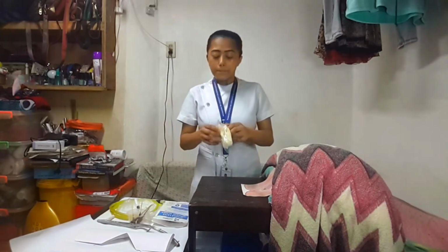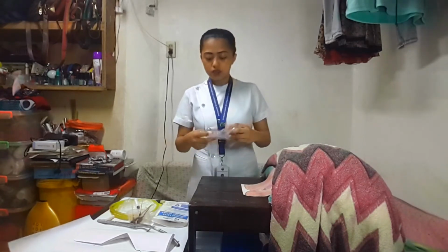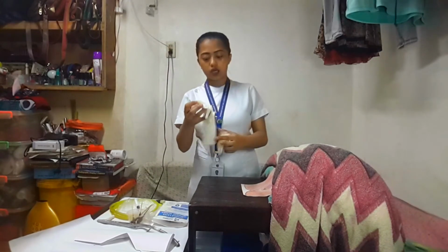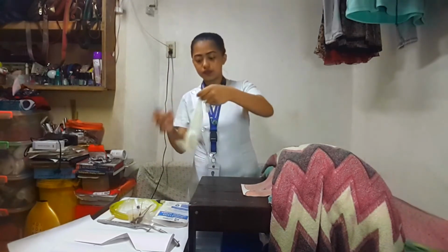So we will now proceed to opening the catheterization kit. For this, we need to wear clean gloves. There are a lot of gloves, but for this time we have to wear a clean one.